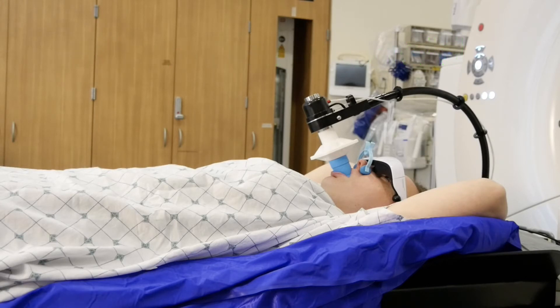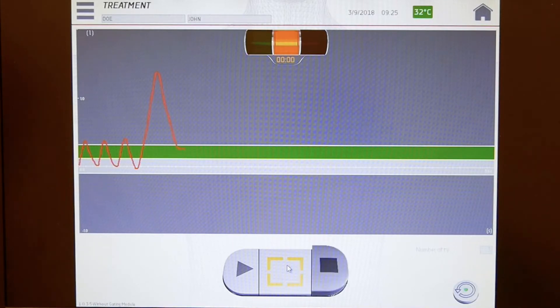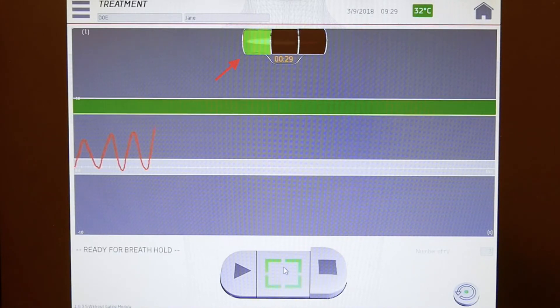We will guide you through what you will see for both conditions. You will see the same screen during simulation and treatment. If the treatment area is in your chest, you will hold your breath after inhaling. The therapist will ask you to take a series of normal even breaths. Allow your exhalations to fall within the middle of the gray band on the screen. Once the therapists are ready for you to hold your breath, the green light will turn on, indicating to you to take a deep breath in and hold your breath within the green band for a certain period of time.